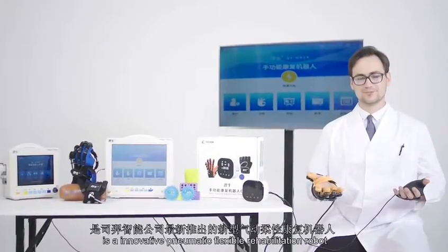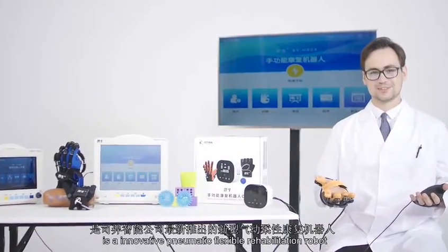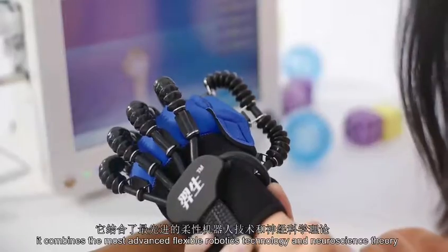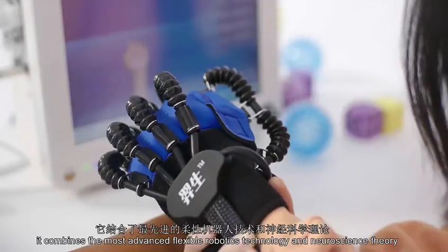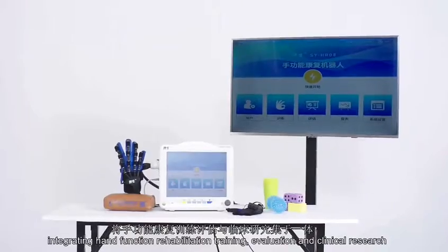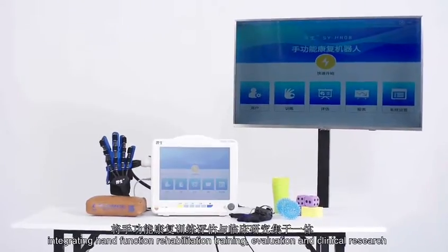YS Rehabilitation Robot Glove is an innovative pneumatic flexible rehabilitation robot. It combines the most advanced flexible robotics technology and neuroscience theory, integrating hand function rehabilitation training, evaluation and clinical research.